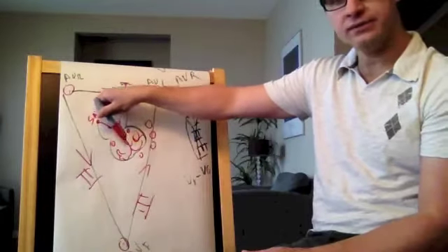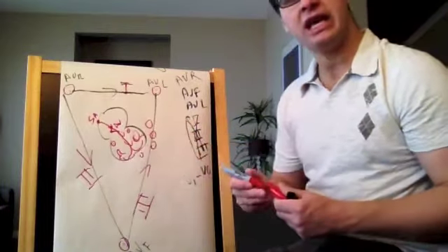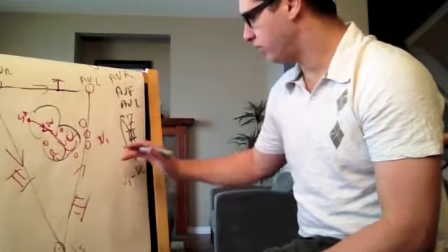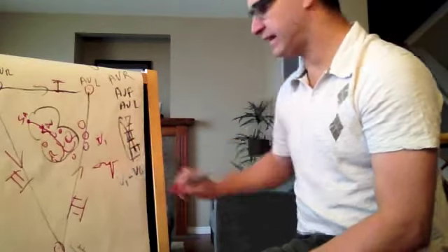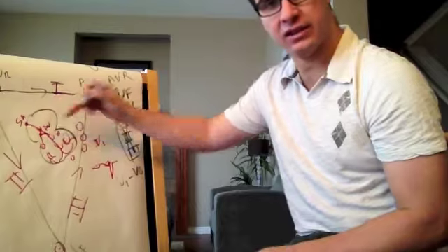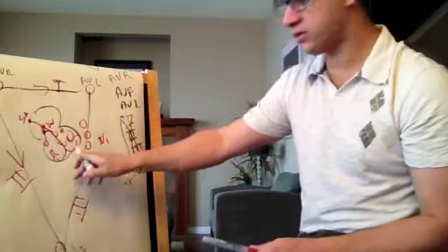So as the electricity is going, because AV looks kind of like this, electricity will do a little burst, and then we'll come back here, and then we'll turn. And this is an important thing to remember, because V1 will sometimes look like this, as this will be very little. And the reason is this thing. Little part will go towards it, and that's that little deviation right over there. So it's that little deviation that's going over there, but mostly it will go negative because all the electricity will go the other way.